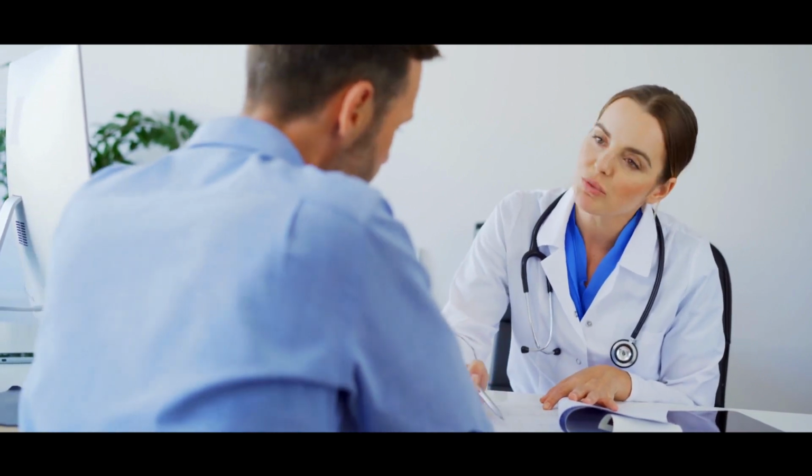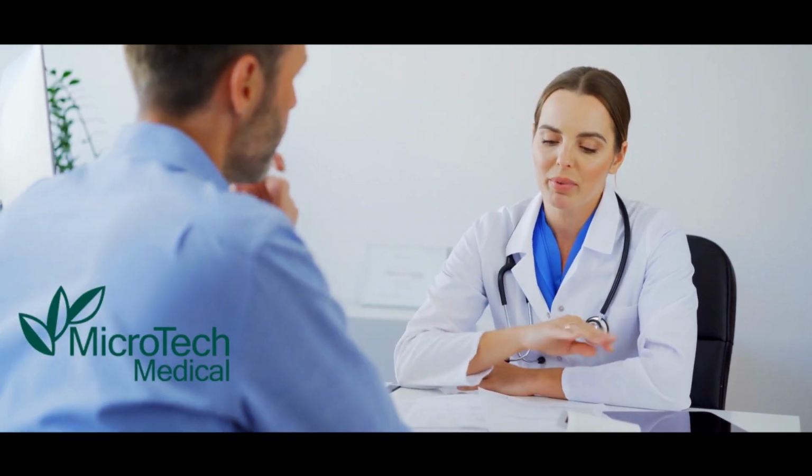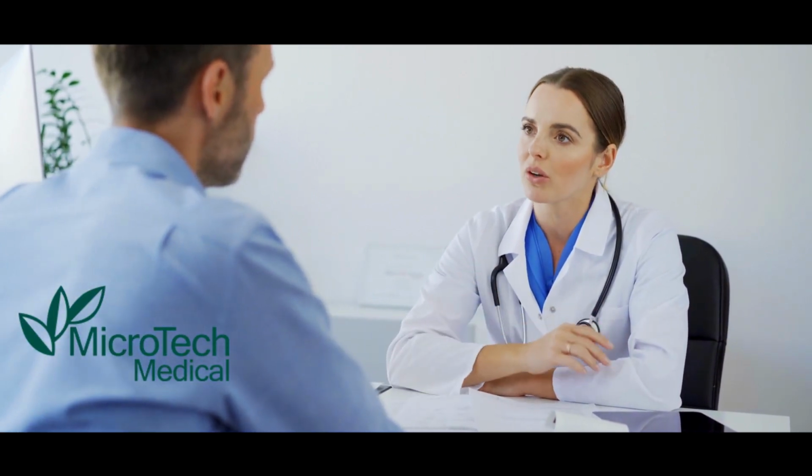Please note that all the information in the video is intended to explain the functionality of the Equil Pump Bolus Calculator function only. However, the parameters needed for the bolus calculator to function are ultimately decided by the attending physician and after receiving training from Microtech Medical's accredited bodies.